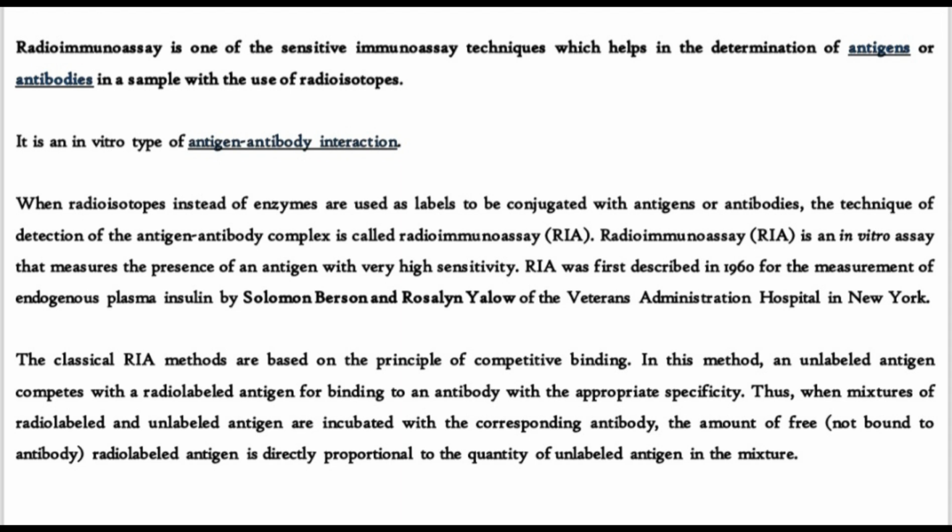RadioImmunoAssay is an in vitro assay that measures the presence of an antigen with very high sensitivity. RIA was first described in 1960 for the measurement of endogenous plasma insulin by Solomon Berson and Rosalyn Yalow of the Veterans Administration Hospital in New York.